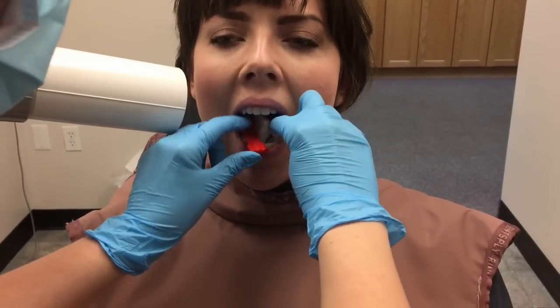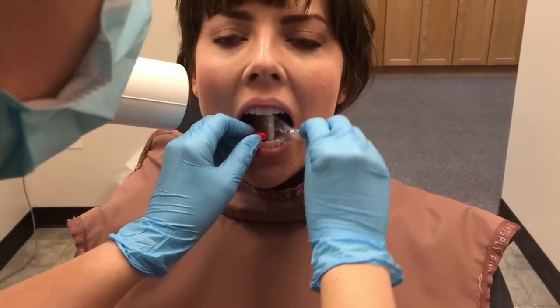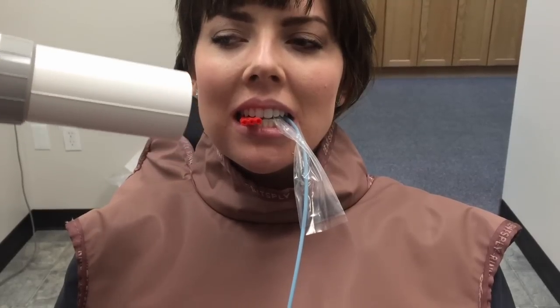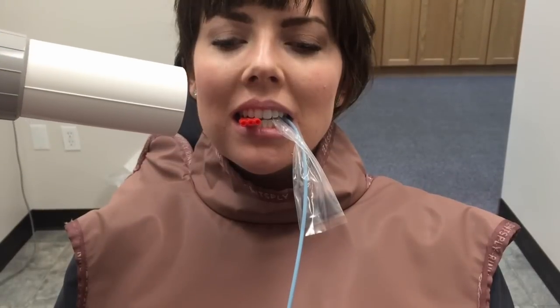I'm going to leave it right in her mouth and take it for the pre-molar shot. Move it towards the tongue, and the cord is going to come out over the opposite canine for the pre-molar shot, then bite together. Then take it out. The center of the PID is going to be lined up right with the bridge of her nose for the pre-molar shot, and then expose it.